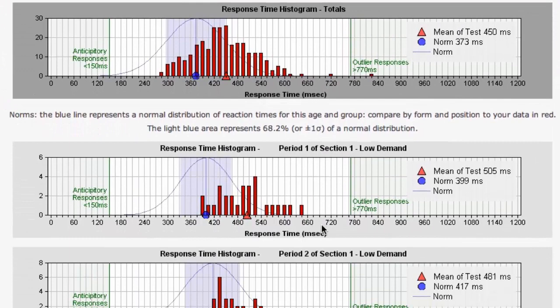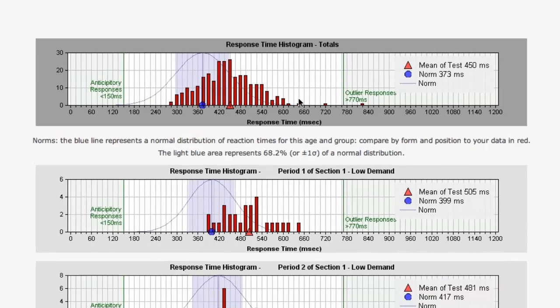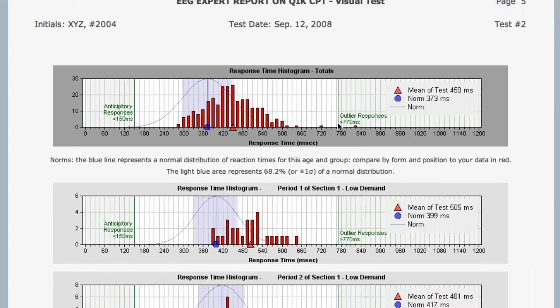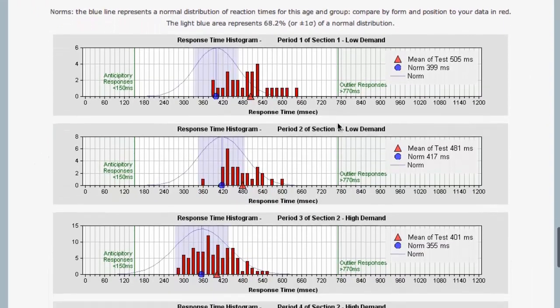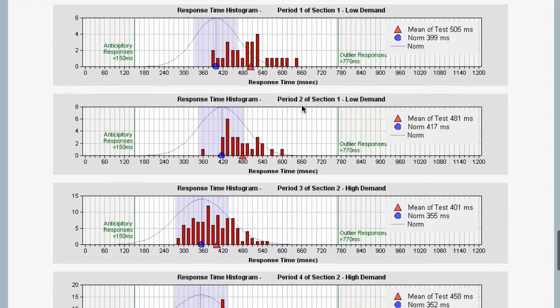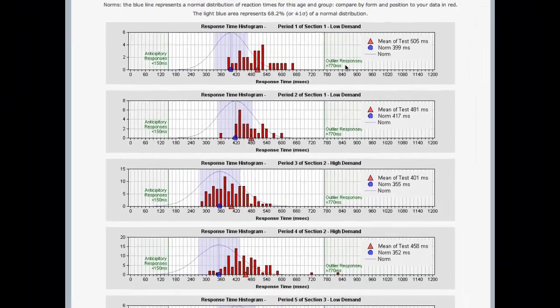Once they're tired and they've handled this long, boring 20-minute task, now we throw this slow challenge at them, which can be even more challenging for people to hang in there through. So we do see more omission errors, and I'm really pleased with the Quick Test for that reason. Here we see the variability mapped out so clearly — we can see the outlier, and we can see those slow and fast responses, and what that distribution looks like.